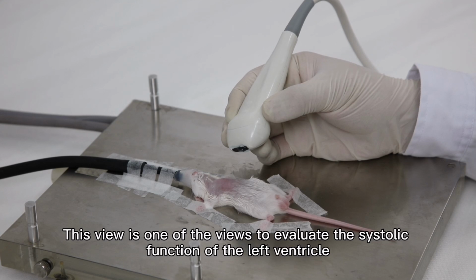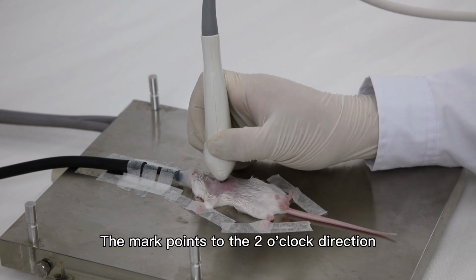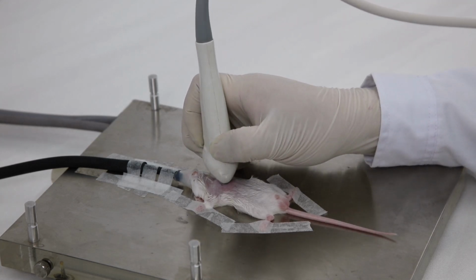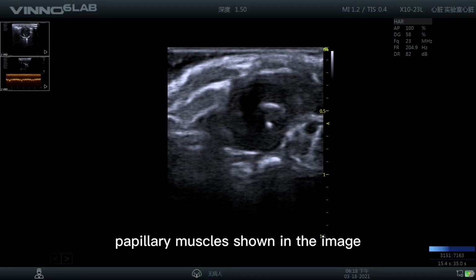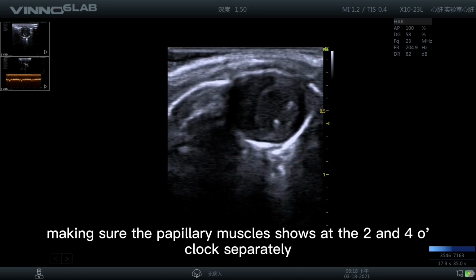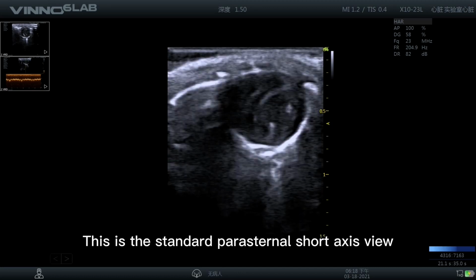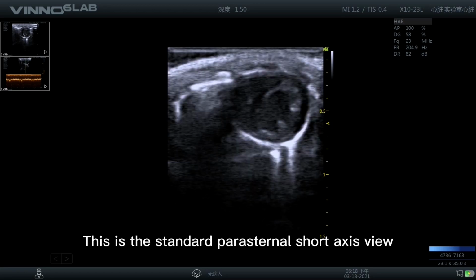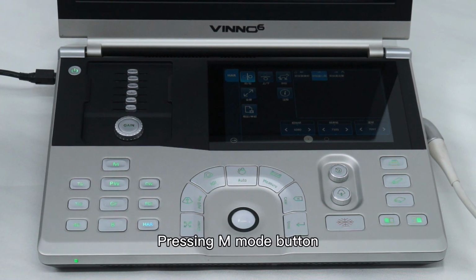Parasternal short axis view. This view is one of the views to evaluate the systolic function of the left ventricle. The mark points to the 2 o'clock direction. Adjust a little bit until the left ventricle papillary muscles are shown in the image, making sure the papillary muscles show at the 2 and 4 o'clock positions separately. This is the standard parasternal short axis view. Press the store button. Press the M mode button.